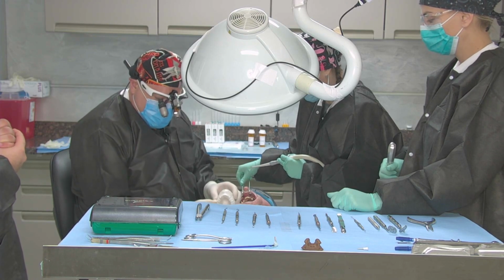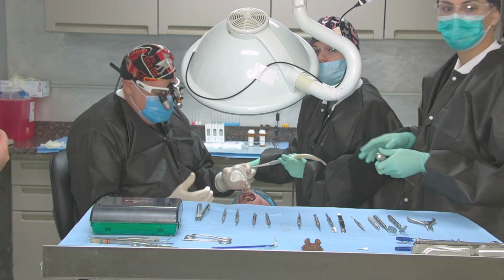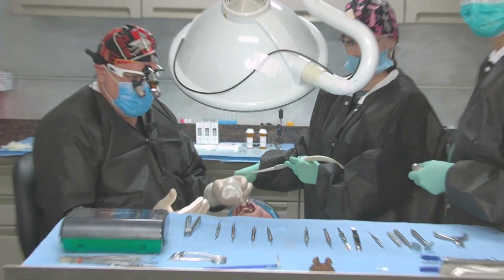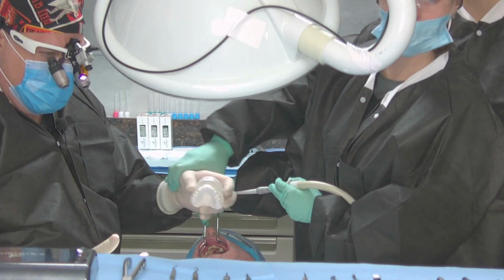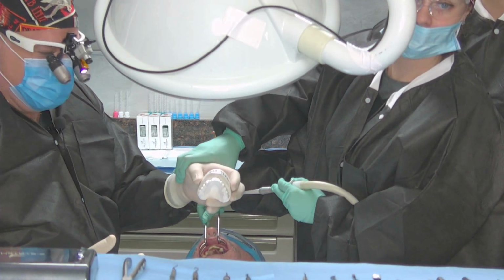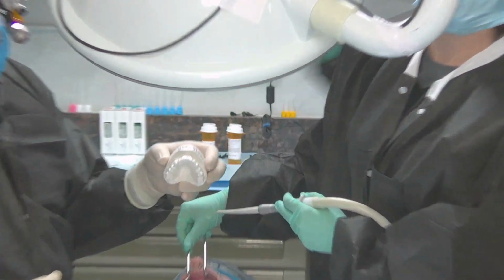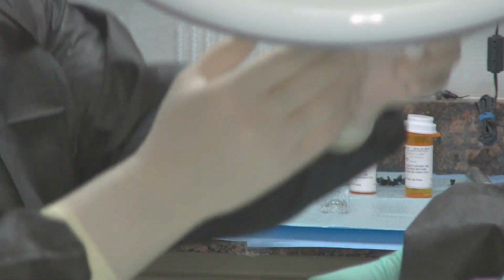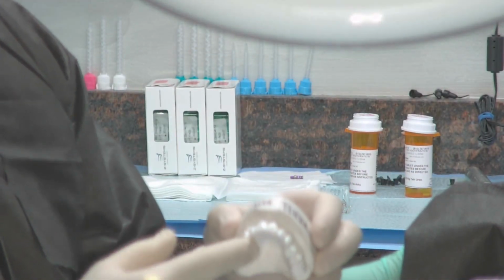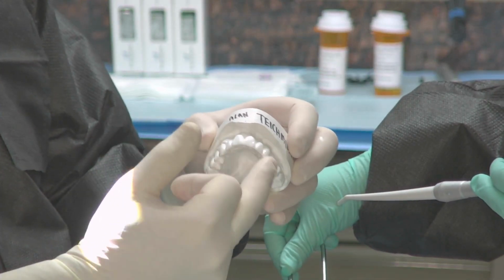So one of the things that I do when I set these cases up, before we do anything, is we take our records on our patient. Those records, am I on the camera or no? Here? Okay. That's Nicole, by the way. Okay, sorry. We do this all the time with Nicole. She holds my hands and rubs it around a little bit. There we go. How's this, guys? Is it in the screen? Okay. All right. So we create from our records a diagnostic wax-up.